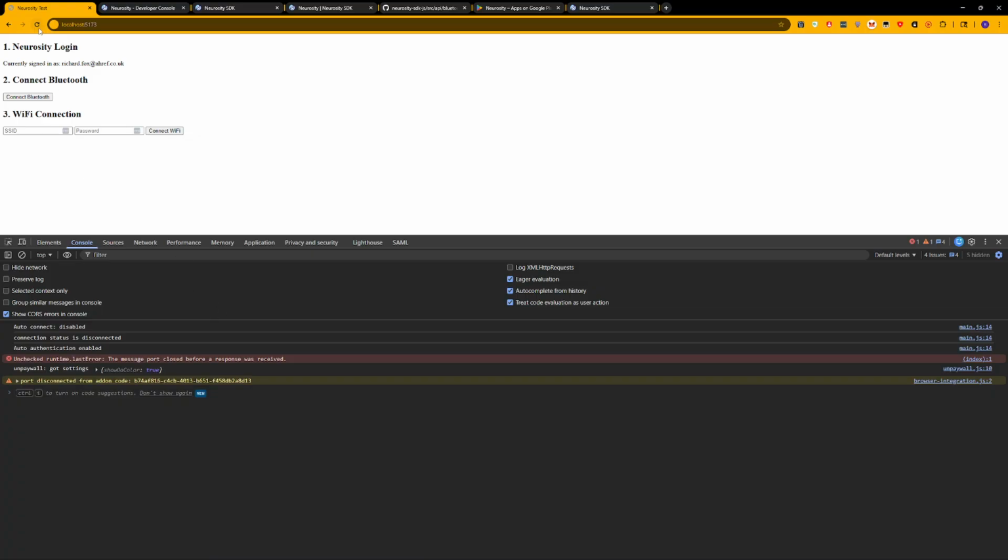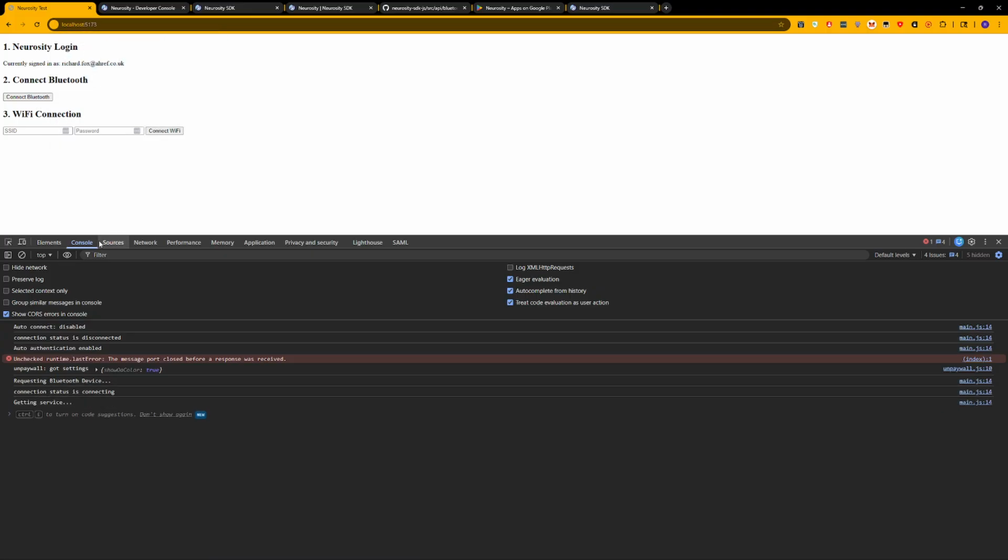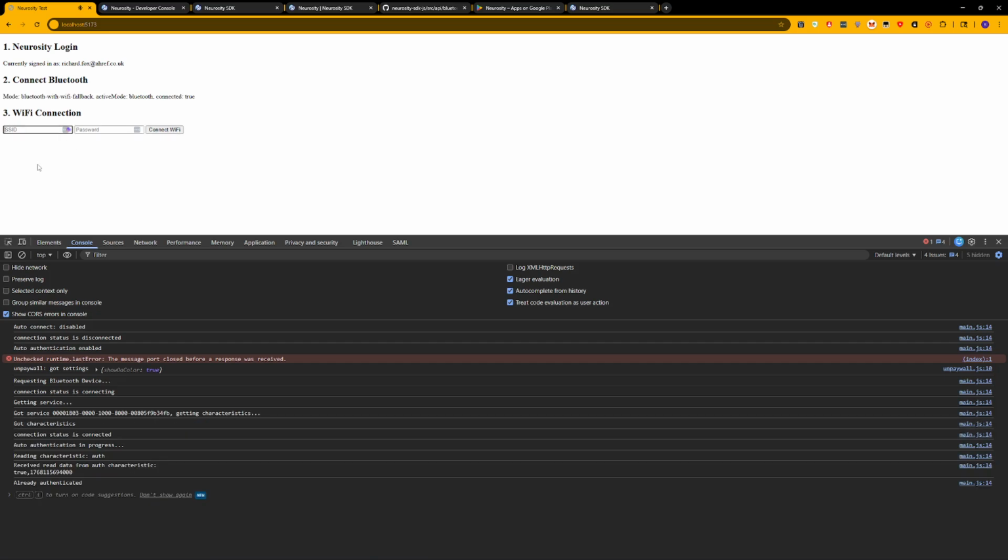So over here is my little test app, and I'll be releasing this shortly. You log in with your Neurosity account. The reason you do that is so that you can claim the device, and that means that the Wi-Fi functionality will work. I don't really want to use the Wi-Fi based functionality except for one of the features, but for people who are stuck and not getting support, this makes sense. So once you're logged in, you can see there I'm logged in. You can hit connect Bluetooth. Crown's propped up. It's on my head currently, and then you input the SSID details here.